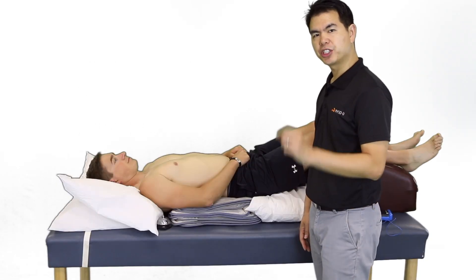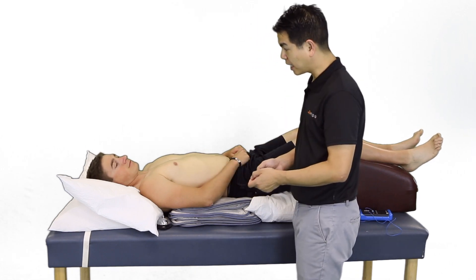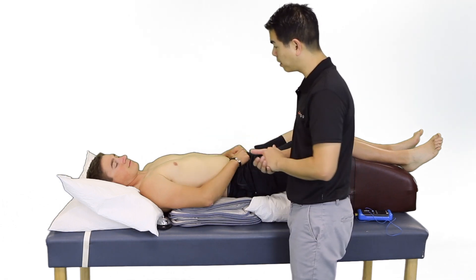After five minutes, I'm going to check on the patient's comfort. I can always remove layers as needed to raise the temperature or add layers to lower the temperature. You can let me know or ring the bell at any time.